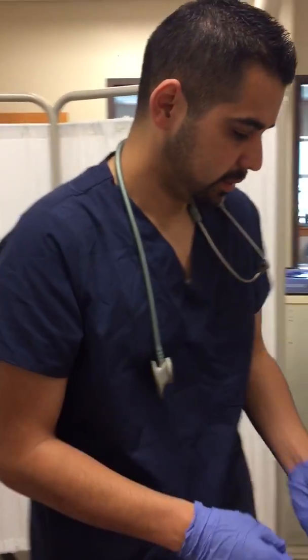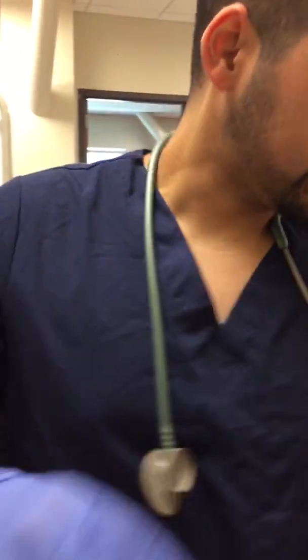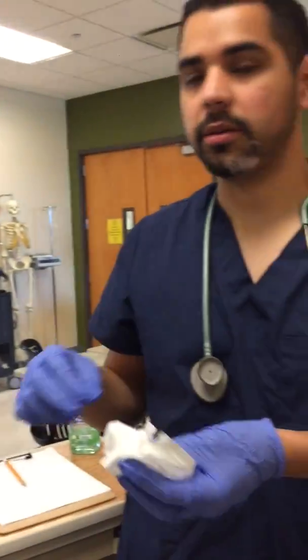Most of the time, if it's still clear, then that's still okay. But if he is having trouble breathing, that means we'll have to give him another dose at a much later time. Everything looks good from here. His cough is productive, and that's great. I always have a cup to keep any sputum that came out, and I'll put that in the cup.